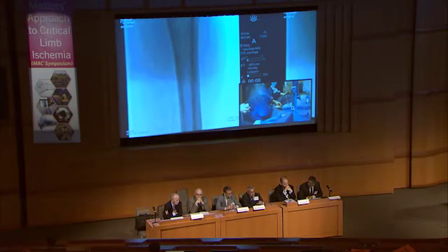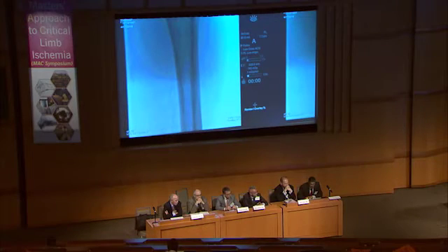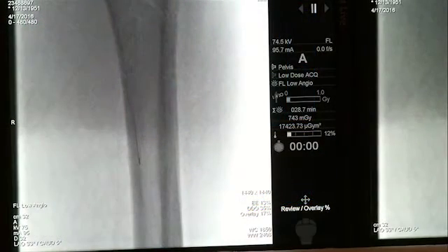Yes, but after the dilatation of the SFA, they can reach with a Berenstein four French catheter, huge lumen and two wires, and come down there. Yeah, I think that's a good point, Marco. So Mehdi, Dr. Manzi's suggestion is that a double wire technique might be time efficient also, but you have gone down, I see. But no, usually it's not necessary. I'm going to balloon this right now.